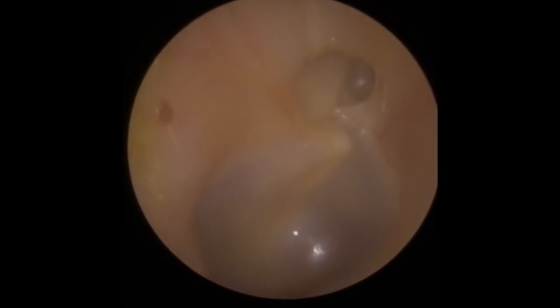Now what I wanted to show you here is a retraction pocket — that's what the arrow is pointing to there. I mentioned before you shouldn't leave wax in this area. You can see it's got a slight depression — that part of the eardrum is sucked in a little bit more than the rest, so you end up with this little dent. Now if you get wax and skin debris in there, especially if somebody's prone to ear infections, that would be a precursor for possible cholesteatoma. That one looks nice and clear, so no issues there. If there was any wax in that area we would clear it out — you always have to check that area of the eardrum.